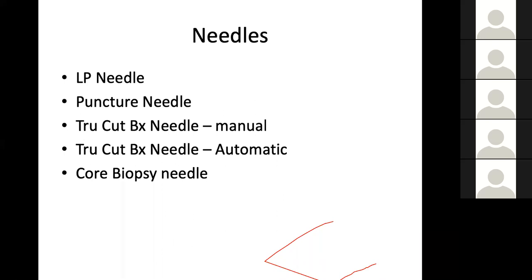a needle is a hollow metal tube which is sharp at its distal end. That is what a needle is. And through this needle, you can pierce into the body, reach a particular part, and this needle can be used to inject something or pass a wire. Anything which is not hollow is not a needle. Anything which does not have a sharp tip is not a needle.